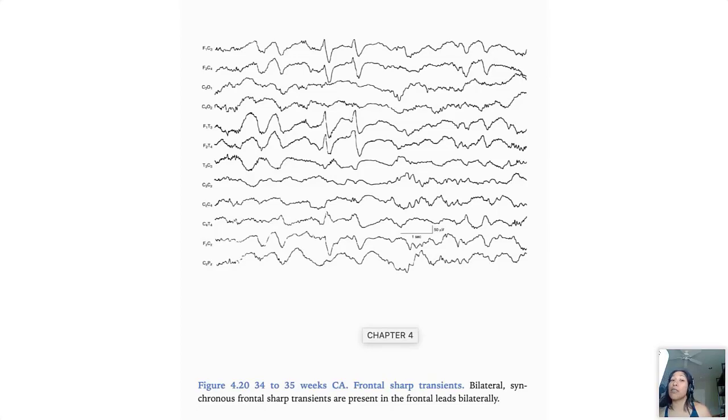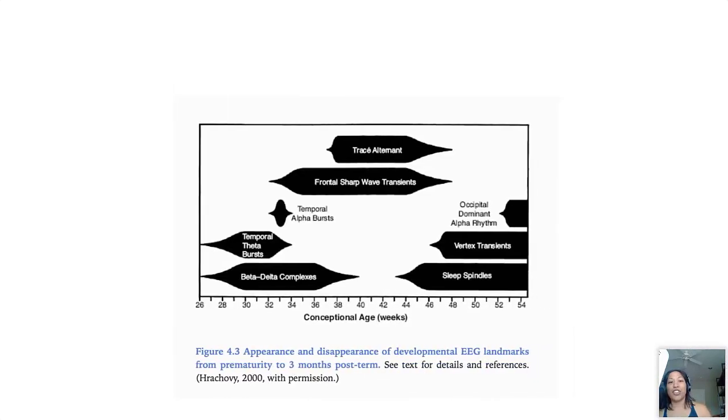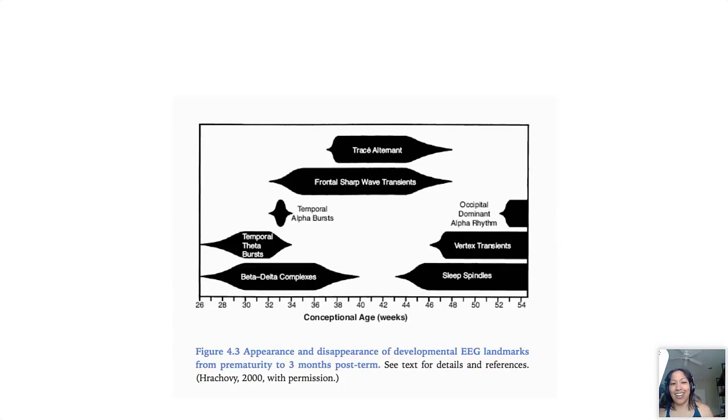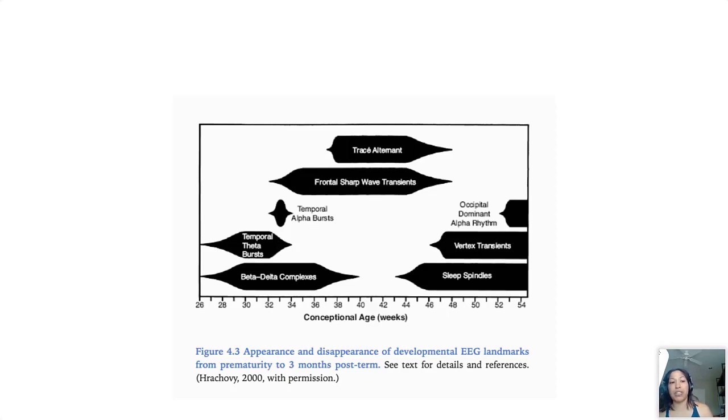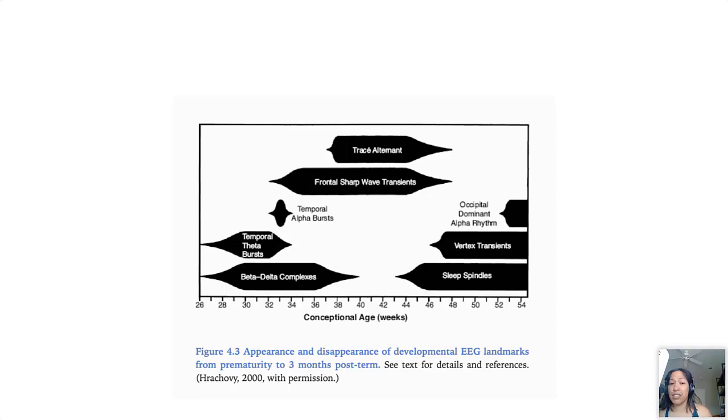And this is a figure example from the same Eli Mizrahi textbook where you can see that it's maximal in the bilateral frontal regions, it is normal and not epileptiform. To kind of go over when would you see these frontal sharp wave transients—I refer to this graph all the time, it's one of the favorited photos on my phone because I refer to this so much. But on the x-axis we see the conceptual age in weeks all the way down to 26 weekers, occasionally EEGs do happen with preemies that small, and going all the way out to like a couple months of life or so. Essentially you'll see for these frontal sharp wave transients starting as early as around 32-week preemies all the way until about six to eight weeks of life in a term baby, and it would be normal for that time.